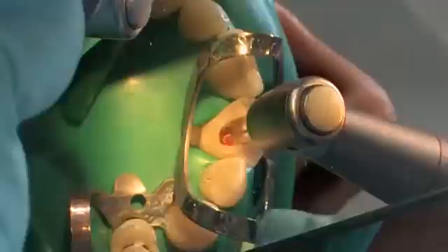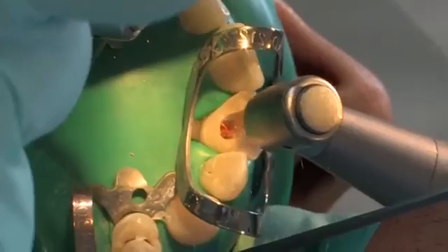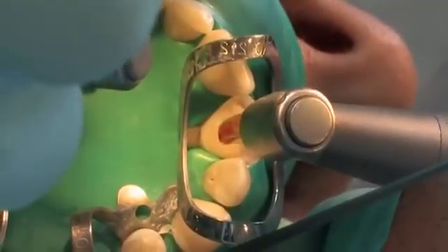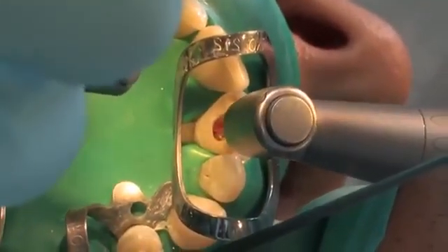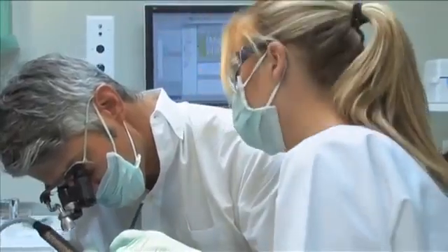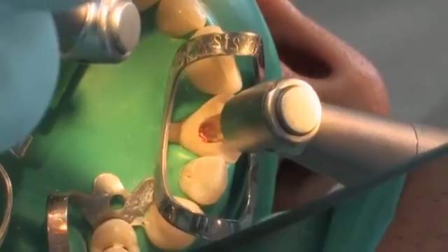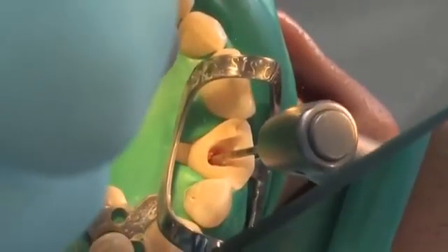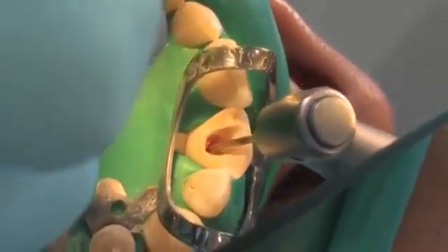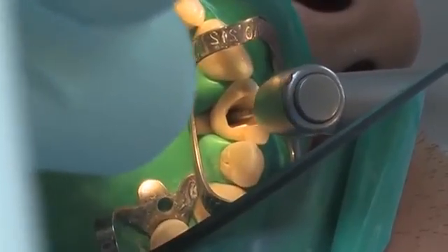The root canal filling material is removed to the predetermined depth using suitable root canal instrumentation. At least 4–5 mm of root canal filling should remain intact for an apical seal. The post space is then prepared using the colour-coded parapost drills in sequentially larger sizes until the predetermined post diameter and depth is achieved.